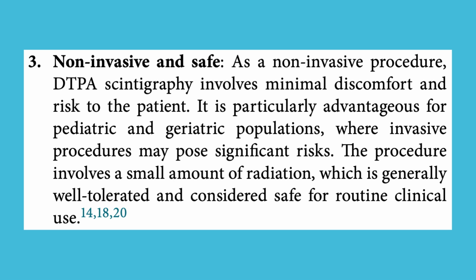3. Non-invasive and safe. As a non-invasive procedure, DTPA scintigraphy involves minimal discomfort and risk to the patient. It is particularly advantageous for pediatric and geriatric populations, where invasive procedures may pose significant risks. The procedure involves a small amount of radiation, which is generally well-tolerated and considered safe for routine clinical use.